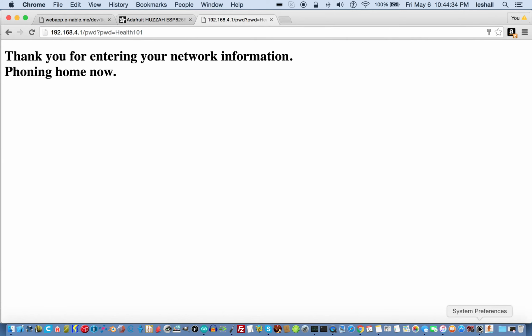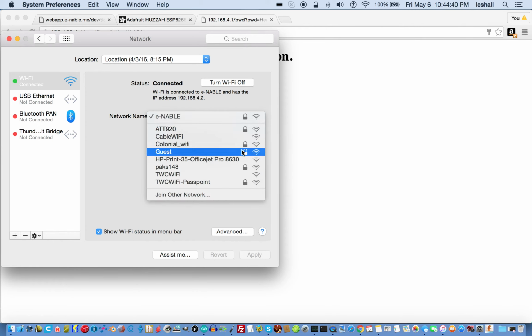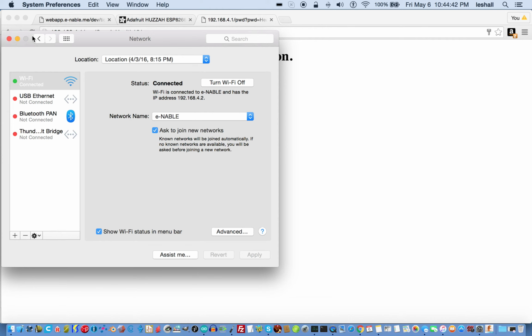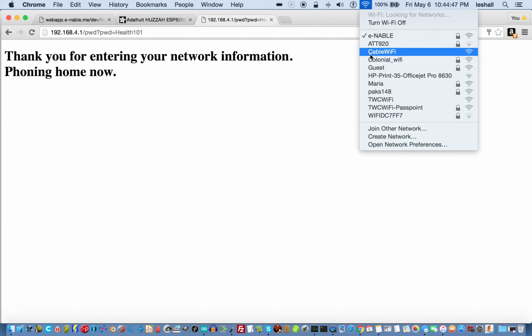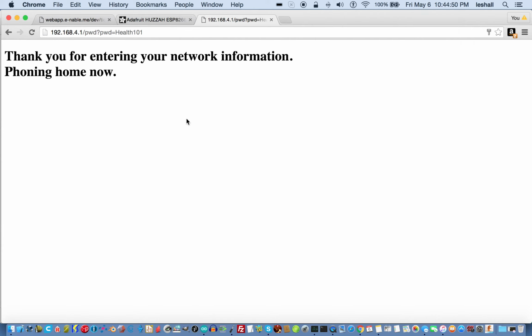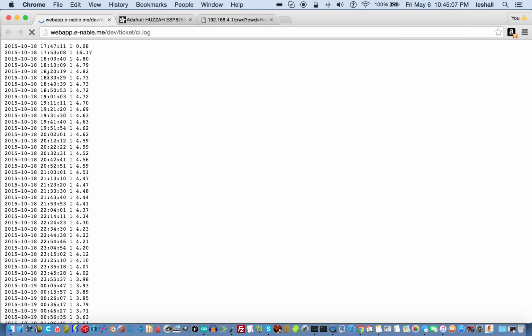alright, we need to go to our guest account. Well, let me do that here. Pardon my delay here. The guest account will connect me back to the internet. We're off the device, and the device is now sending messages. To where? To this log entry, where I'm going to reload it. Okay. It reloaded.